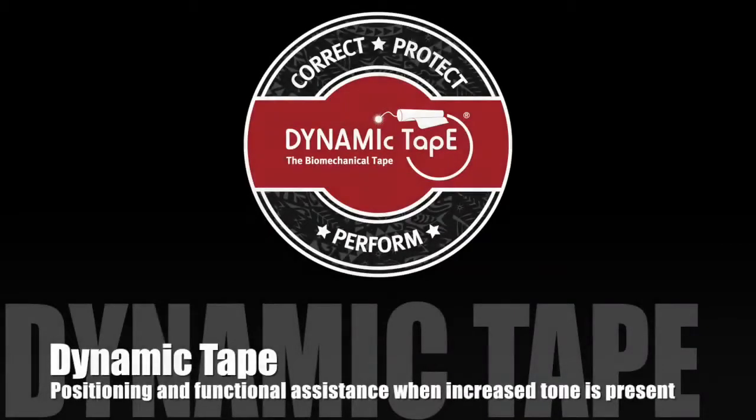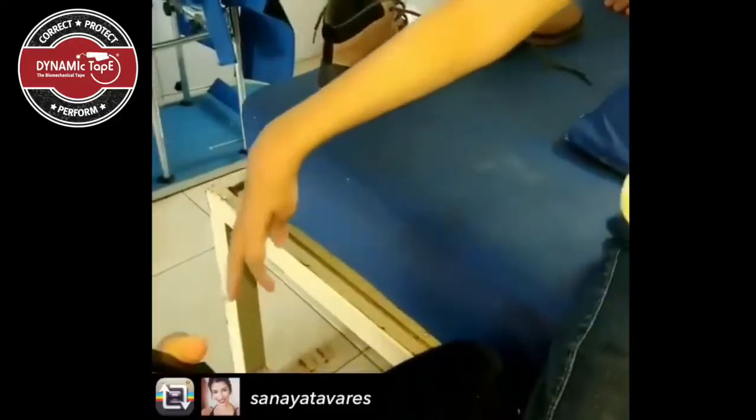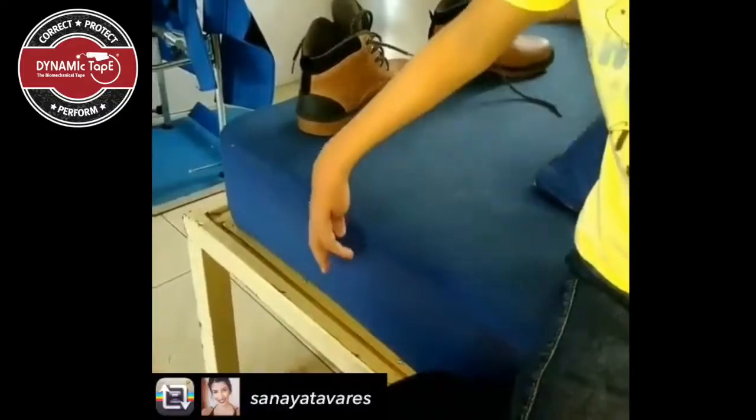This video shows the changes that we can get when we tape mechanically and the effects on tone. Here we can see a very flexed wrist and flexed and adducted thumb, extended elbow, and difficulty weight bearing or getting into a position to weight bear through the wrist.